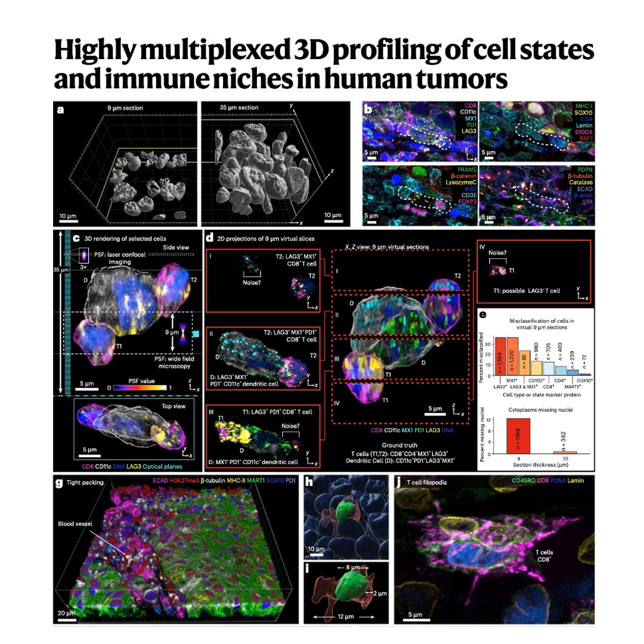And that's what they found. For these polarized proteins like LAG3 and another one called MX1, they saw false negative rates of 30 to 40%. 30 to 40%. So the protein was actually there, the cell was positive, but the standard 2D slice just completely missed that tiny cluster. Precisely. It reported it as negative incorrectly.